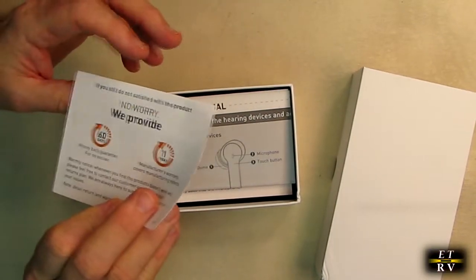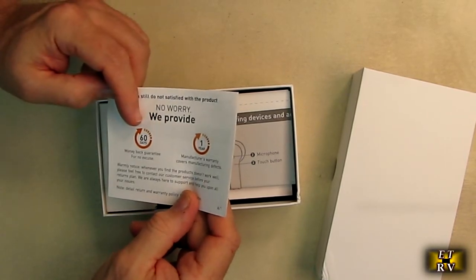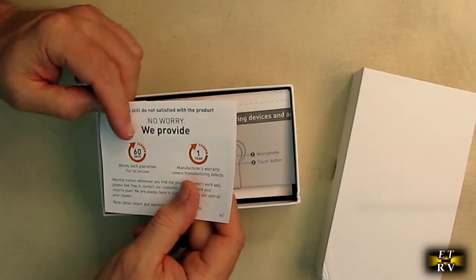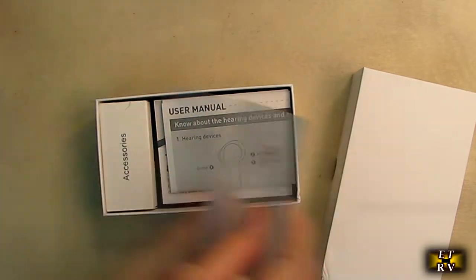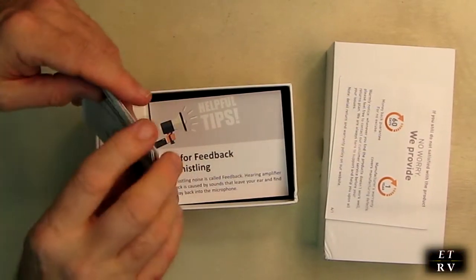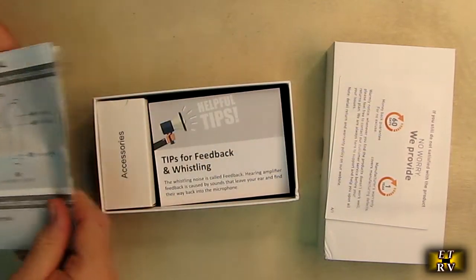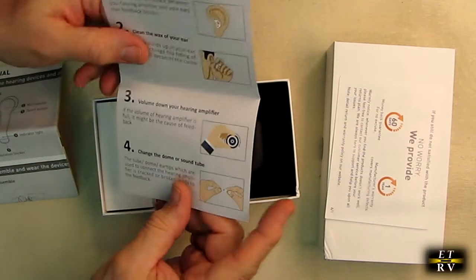It talks about the warranty, 60-day return, one-year manufacturer warranty. Then we have the actual user's manual that tells you how to use the hearing aids and gives tips for avoiding feedback and whistling.